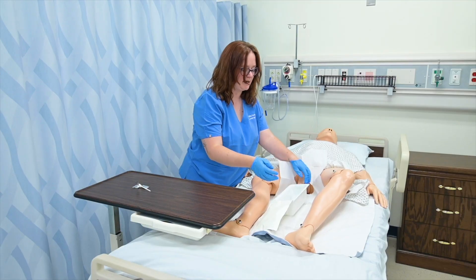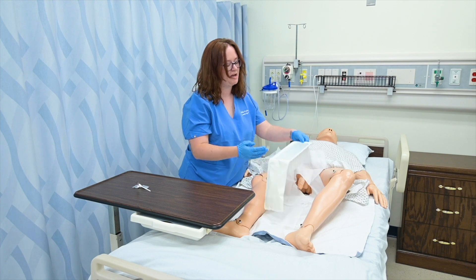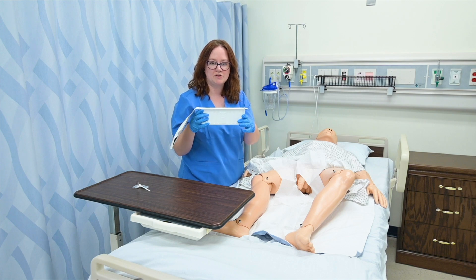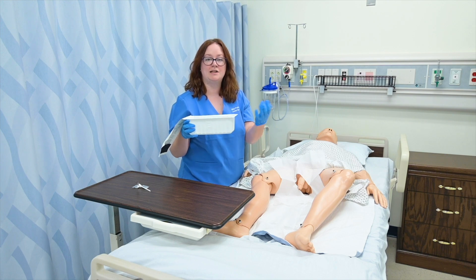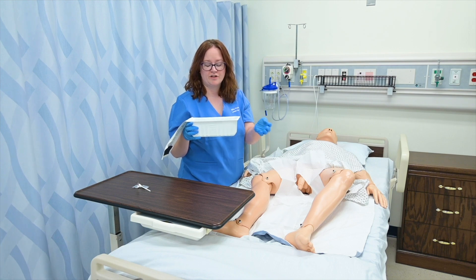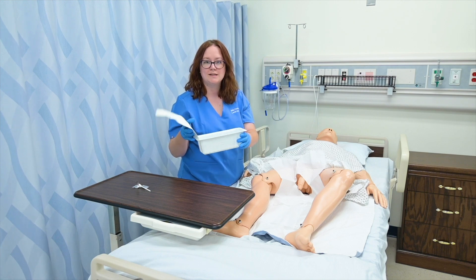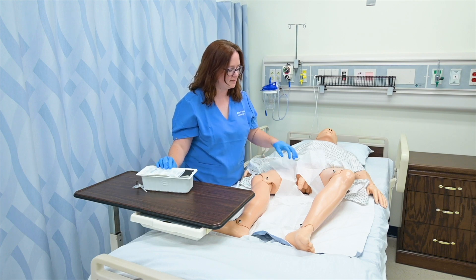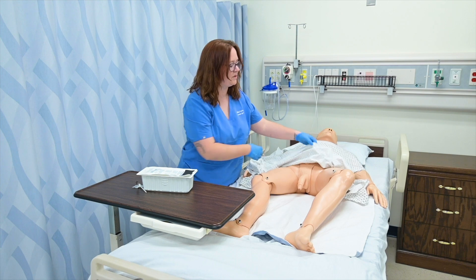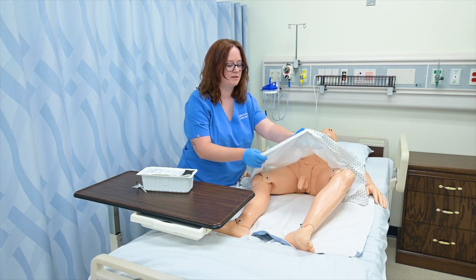When that's done, I now have to make sure that I measure and dispose of this correctly. Most containers have measuring marks on the side. Alternatively, I could dump it into a graduated cylinder or a urinal to measure it more efficiently. Then I would need to waste that urine, discard of this and my other items, and clean and reposition my patient appropriately.